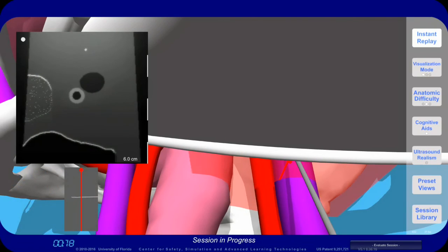In the ultrasound image, you might think you are looking at the needle tip; however, you are actually seeing the shaft of the needle.